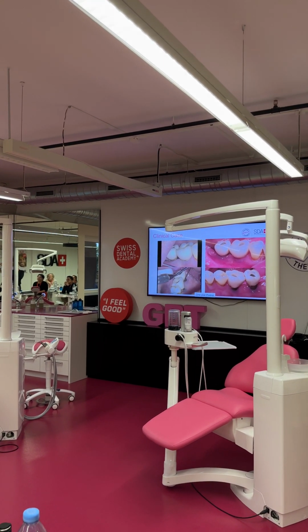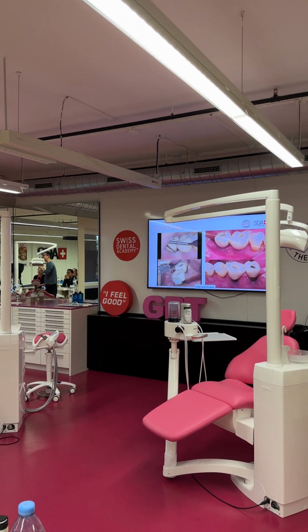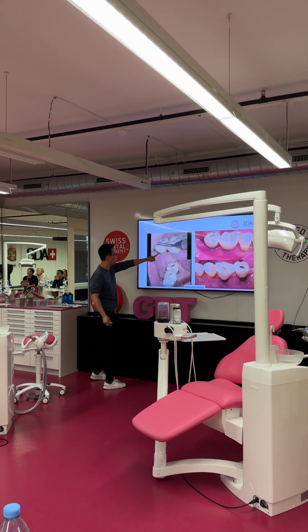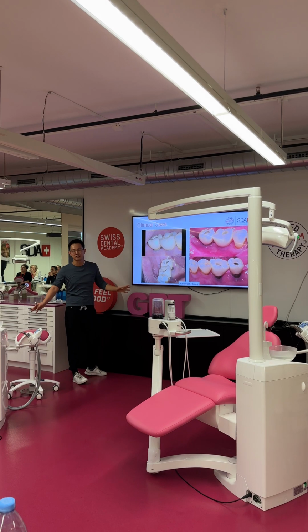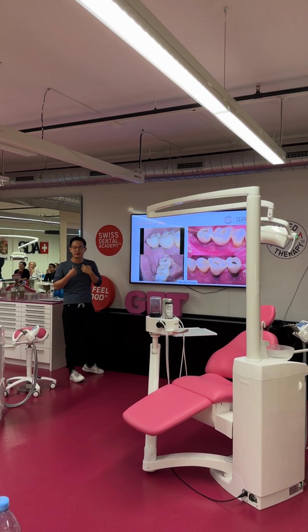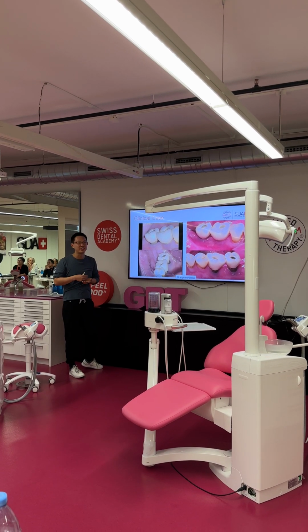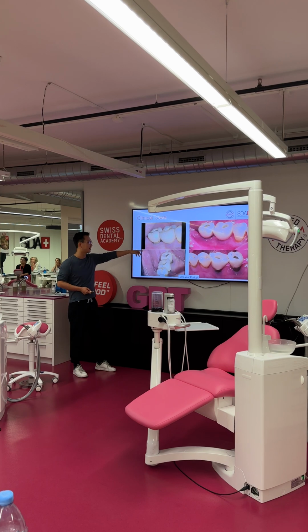So I need to really show you this. One pocket, I just know this may not be ideal with the T-probe. But once again, you see, I wish it could be a huge screen. There's still a lot of bacteria, biofilm around this because it's just rough on the surface. No one's going to clean it. Of course, for periodontists, we can do implantoplasty, smoothing everything, make it a polished surface. But I didn't do the surgery once again.